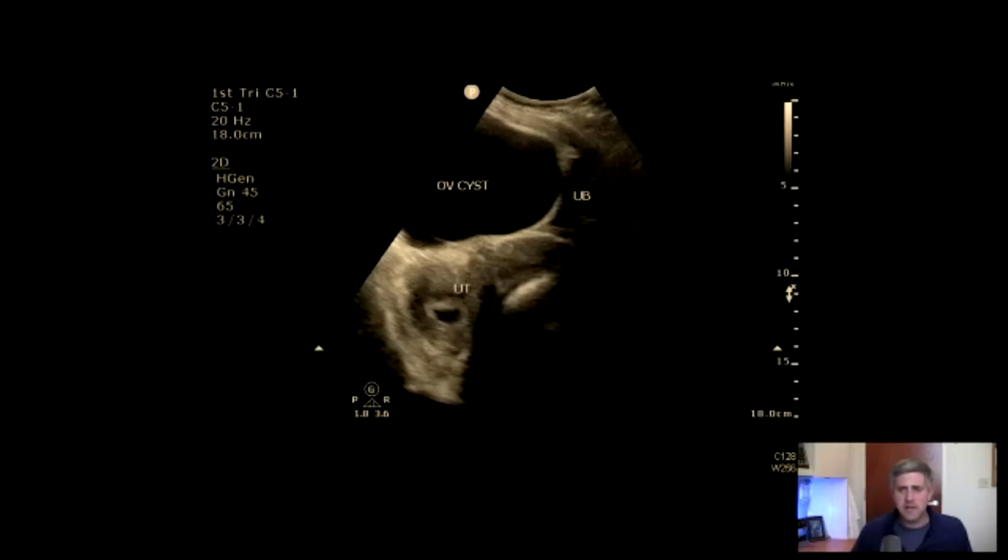And this is why I spent a lot of time really hammering in the anatomy, right? Why you want to definitively identify not only what you believe to be the bladder, but the surrounding structures to confirm that. Not just, it's a fluid collection in the pelvis, it must be the bladder. Say, okay, fine, but is it truly the case? And let me confirm that.